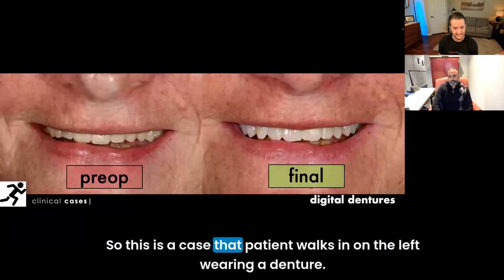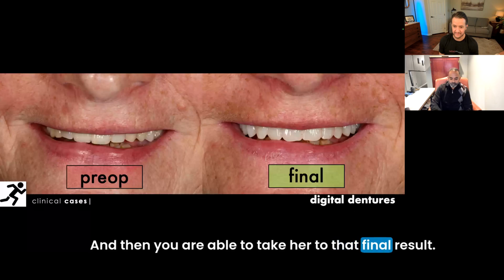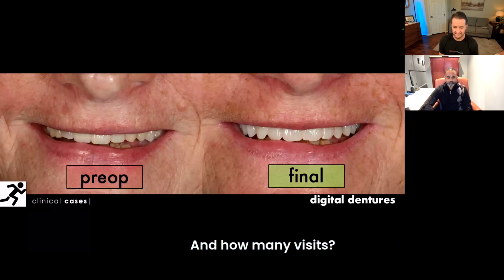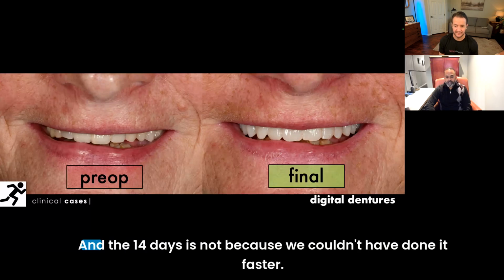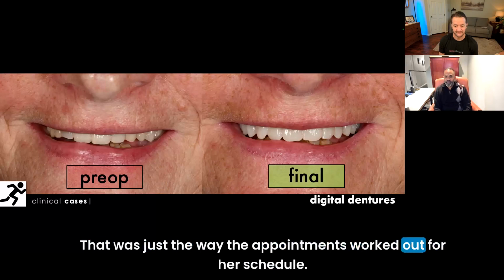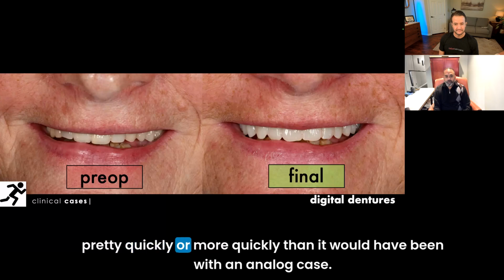So this is a case where the patient walks in on the left wearing a denture, she's unhappy, and then you are able to take her to that final result in how many visits? This was 3 total visits within 14 days. Amazing. And the 14 days is not because we couldn't have done it faster. That was just the way the appointments worked out for her schedule. But the story of this patient is a little more than just the pre-op and the final, and the fact that we did it more quickly than it would have been with an analog case.